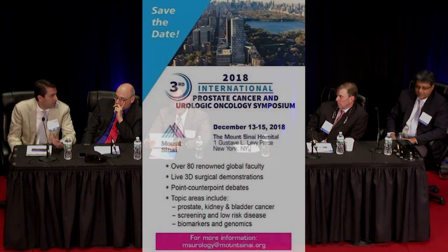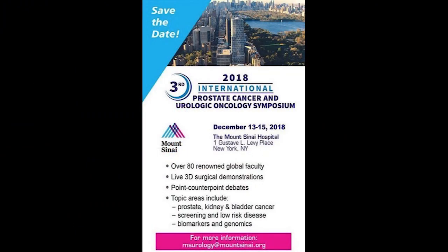Right? And I don't use elastic warping. I think that's overplayed, because if you change the truth of how good an MRI is and you start stretching and moving things around as you move through your procedure, it could limit your ability to sample those areas. That's why this algorithm would get rid of the need to do that. Exactly. Yeah.